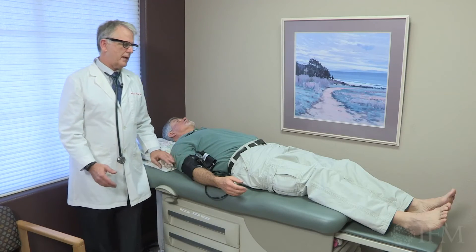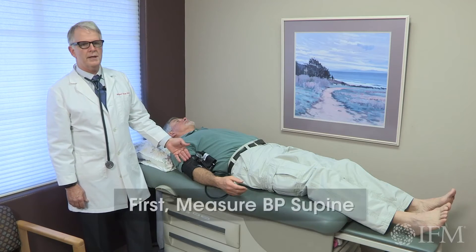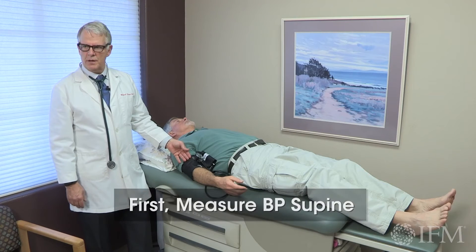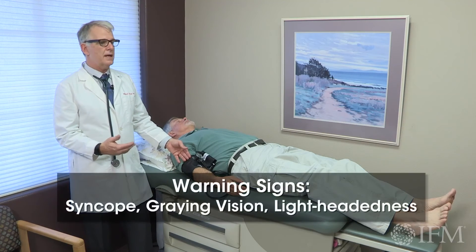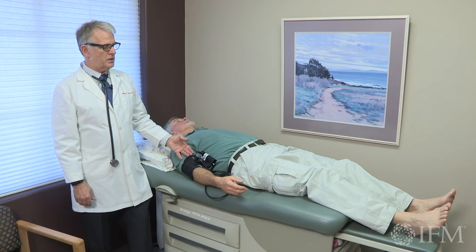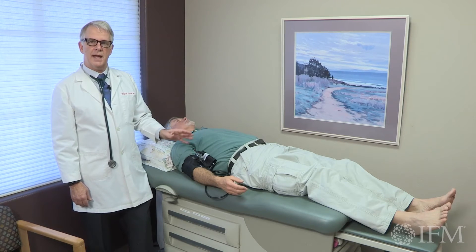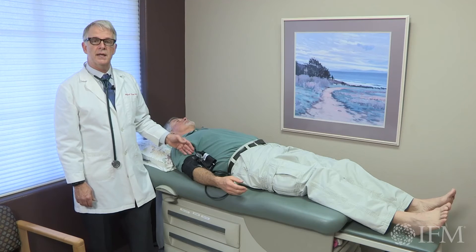When checking orthostatic blood pressures, we of course check the first blood pressure lying down. Depending on what your patient's symptoms are — whether they have syncope or say that any time they stand up they begin to gray out — you may do a three-step orthostatic blood pressure check. You may have them check their blood pressure lying down, then sitting, then standing, recording systolic, diastolic blood pressure and pulses at each stage.